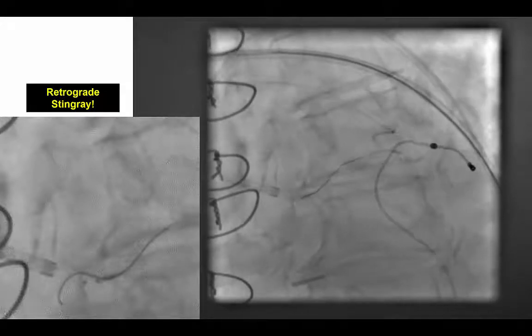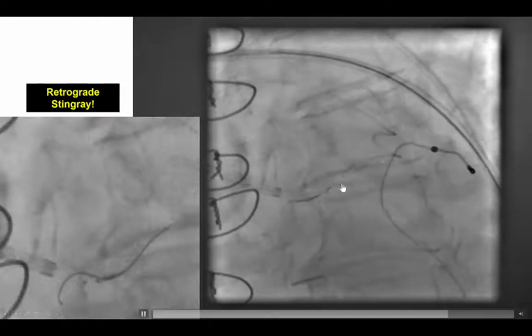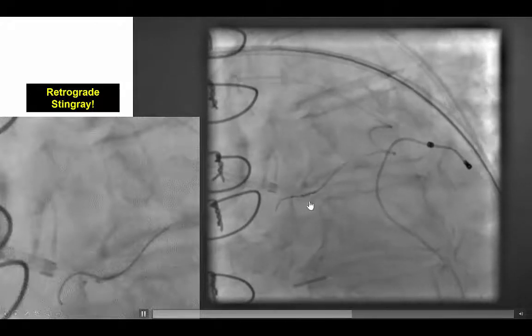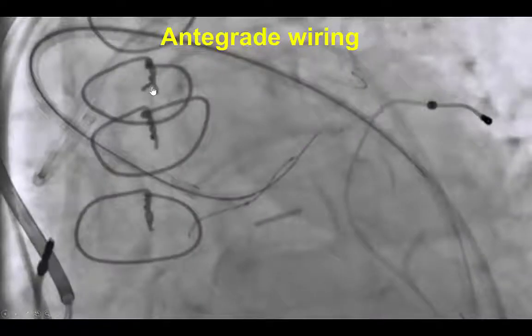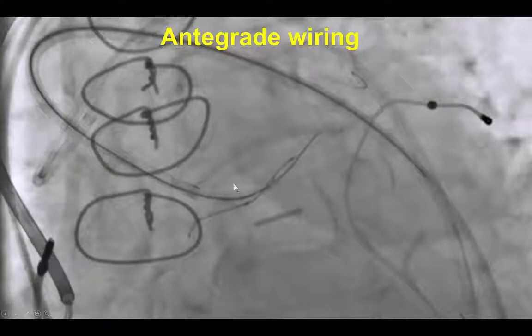We did attempt retrograde stingray. We were able to deliver a stingray balloon through the vein graft, through the LAD, all the way to the proximal LAD at the left main ostium. However, the attempts to gain true lumen access through the stingray were unsuccessful. The retrograde wire did provide a marker for the course of the LAD, and after the wire was left in place, we were able to advance an antegrade wire through the course of the LAD, dilated with a small balloon, all the way to the mid LAD.